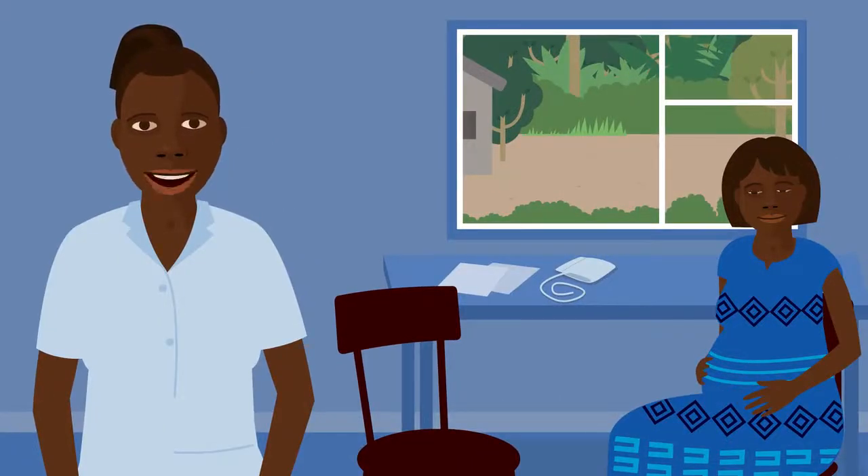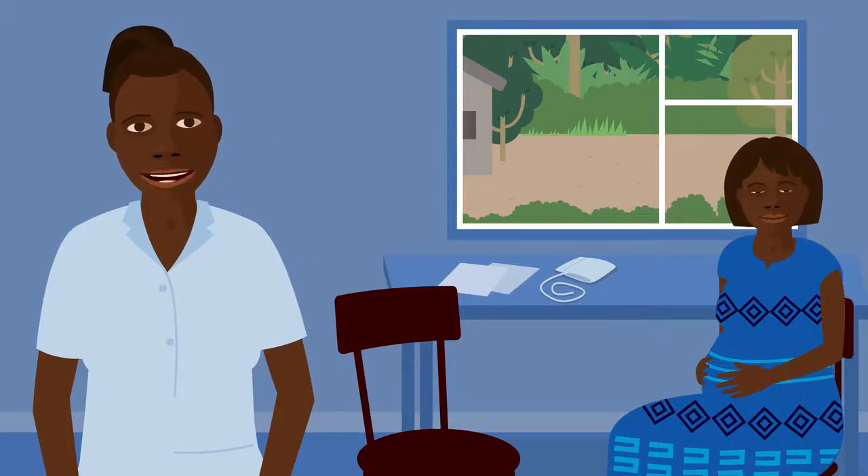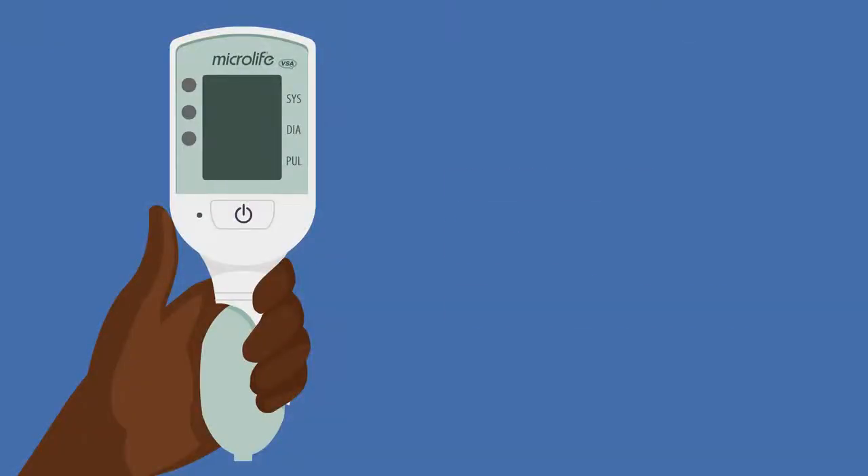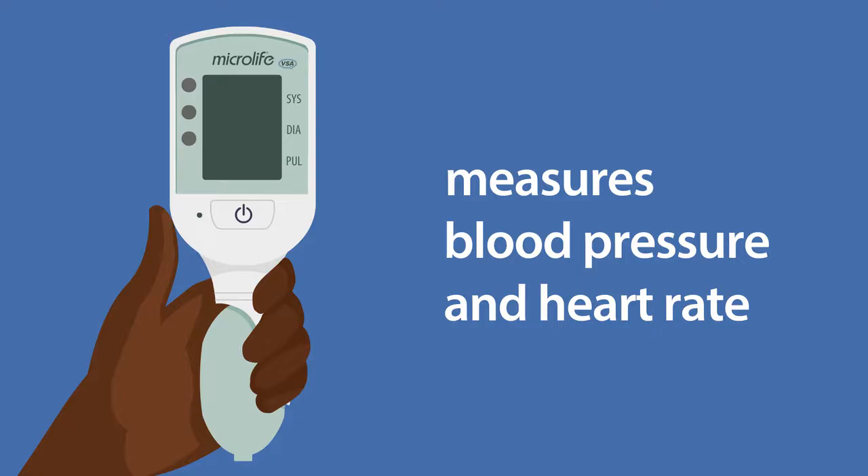Today I'm going to check the blood pressure and heart rate of pregnant women using a Cradle VSA. This is a device that measures blood pressure and heart rate.